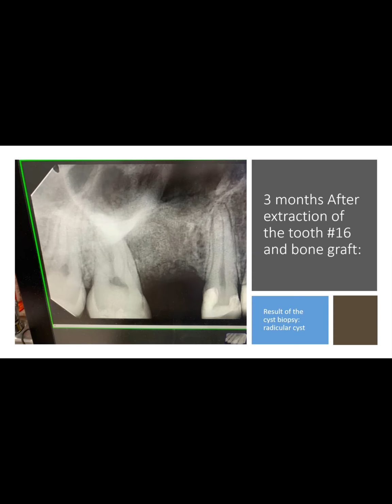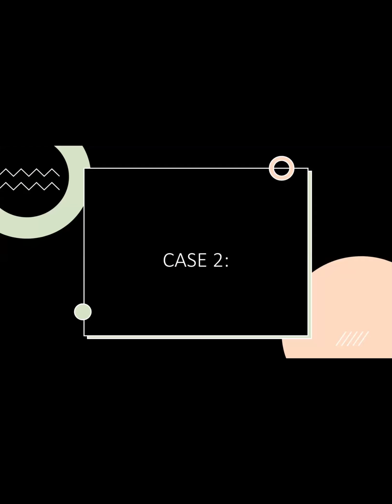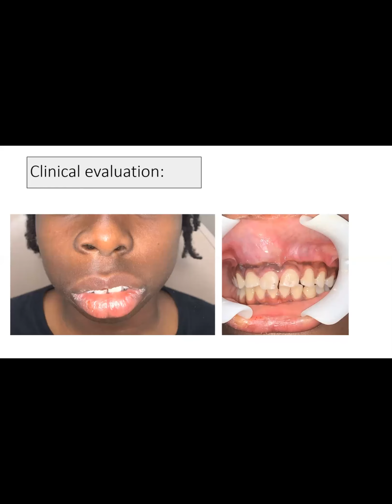All right, now we can go to case number 2. Here's a case that I was actually very angry when I saw, because this gentleman had been twice to a couple of our associates with a swelling, and each time he came, they gave him antibiotics.